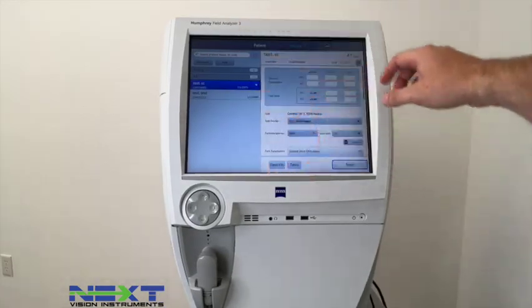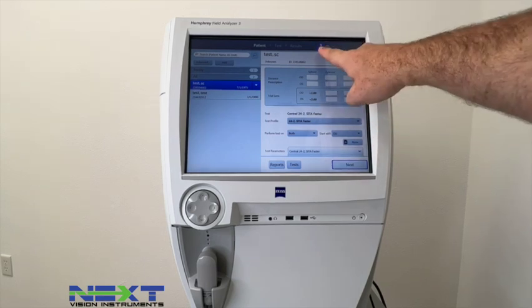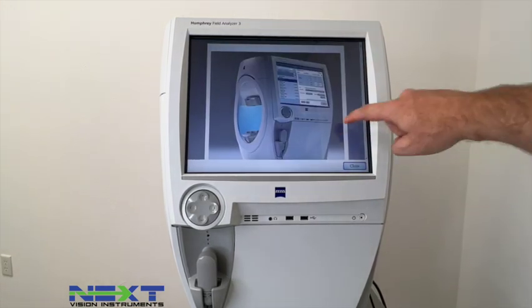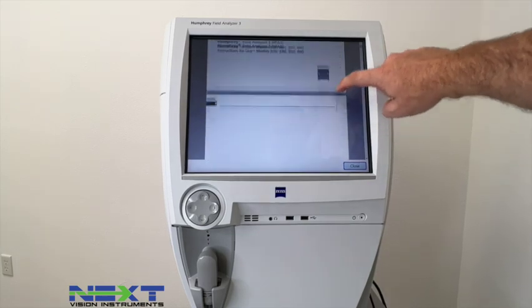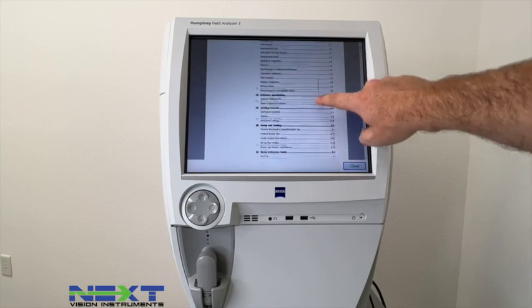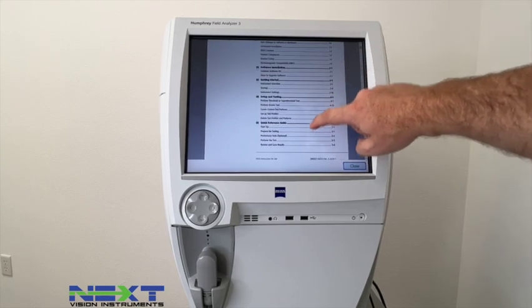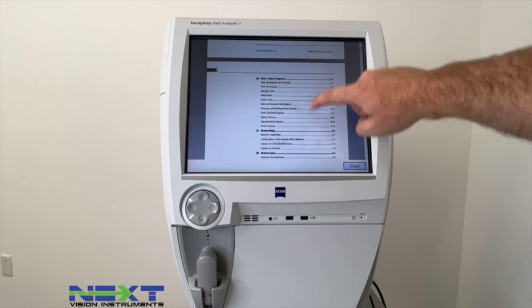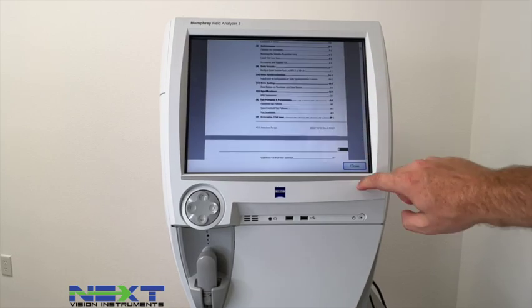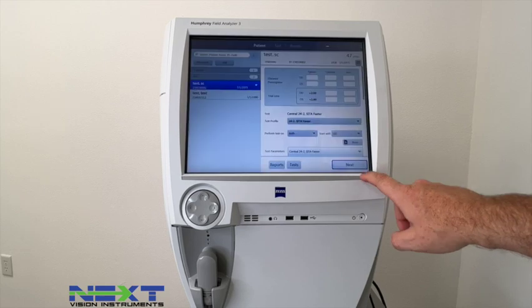From the home screen you can also access the user's manual by selecting the little question mark at the top. It will give you the entire user's manual right there on the unit. We include it on a thumb drive as well for your computer, but you can have it right at your fingertips on the unit itself. When finished, hit Close.